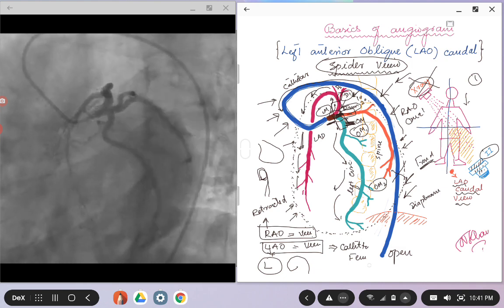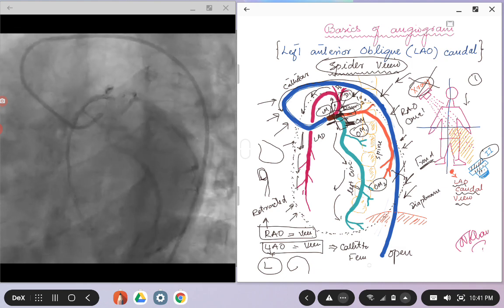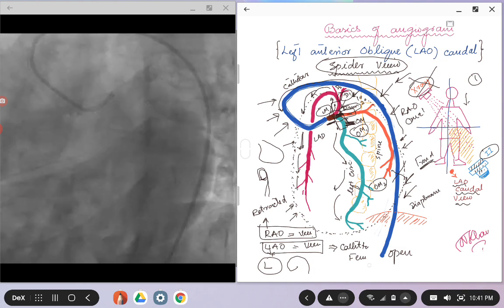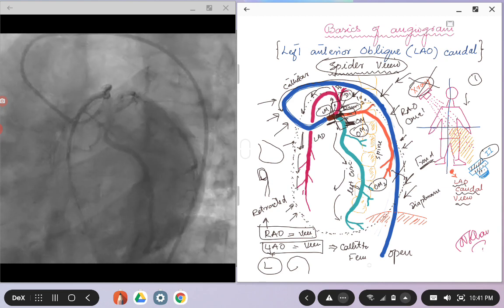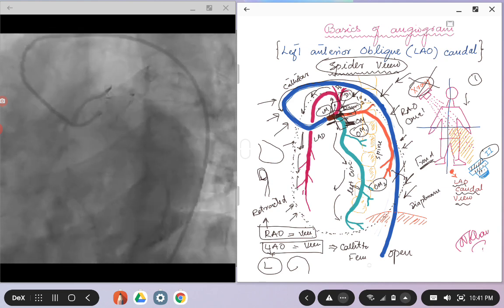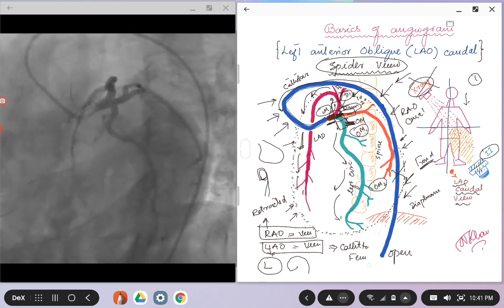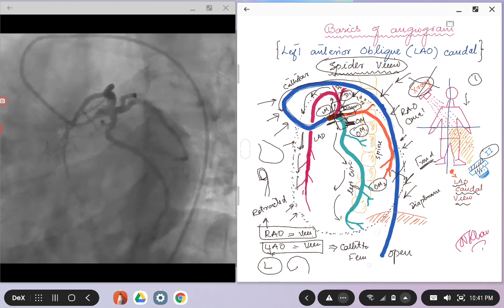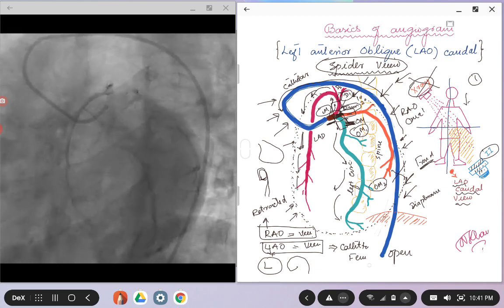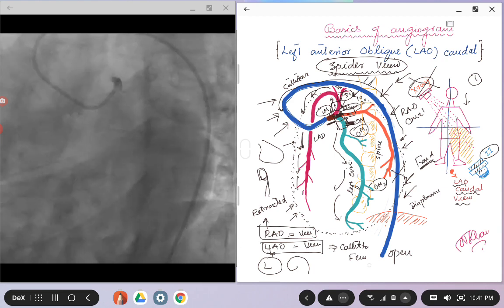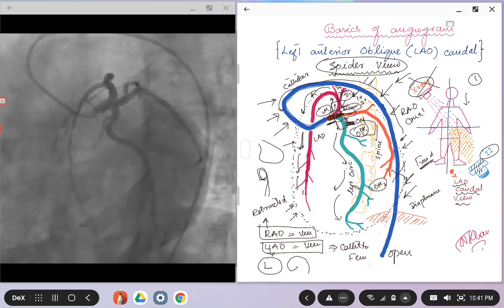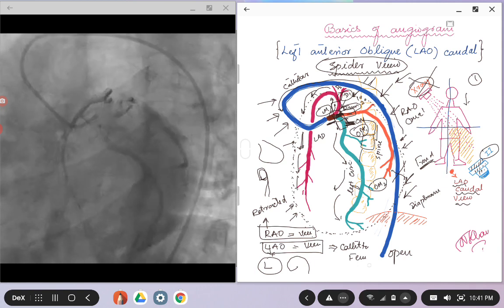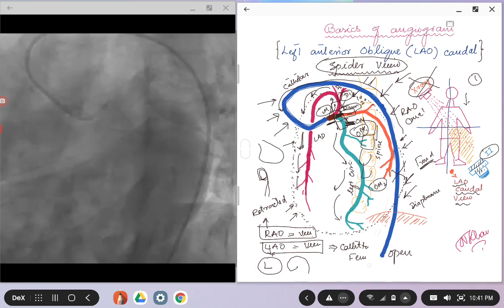I want you to look at the angiogram on the left and try to appreciate the spine. So here I have drawn the spine with a yellow color here.